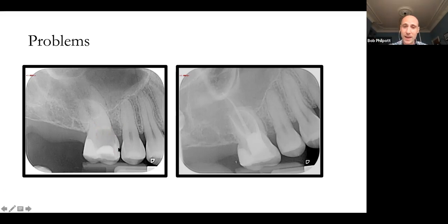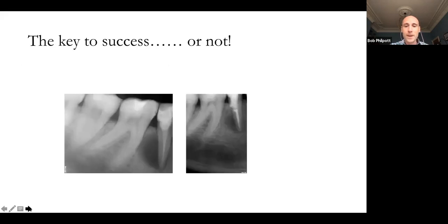And I think what has happened here again is a restoration and roots that are at a funny angle, and then suddenly you just lose your orientation, and then that's your issue. And this is a case I did do, and I show this again. I used to have an image of a dog with a bib sitting in between these two radiographs, but I've taken that out to show that it's an absolute dog's dinner. And this patient was hard to manage because the patient themselves was very adamant they wanted to maintain the tooth, and was also highly anxious about losing the tooth, which is not a great combination. But I've accessed it, and looking at it, I thought, okay, yeah, access, I can do this.